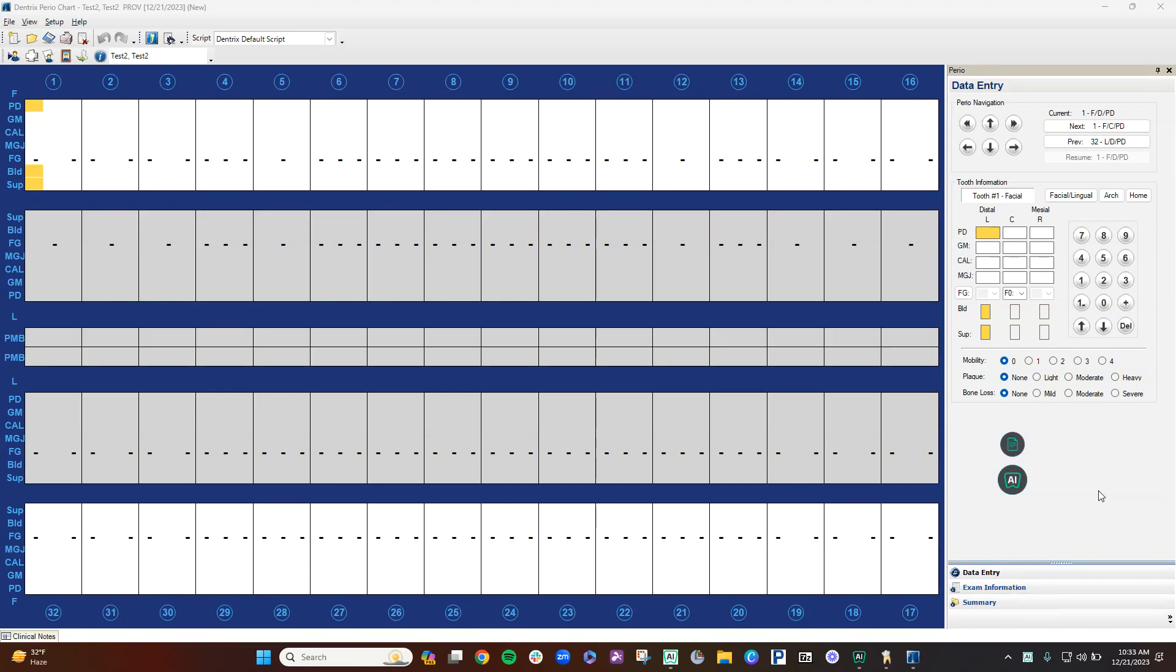I will be giving a demonstration on Voice, the periodontal charting system created by Denti AI. This will be a quick video to show you how Voice works within Dentrix.